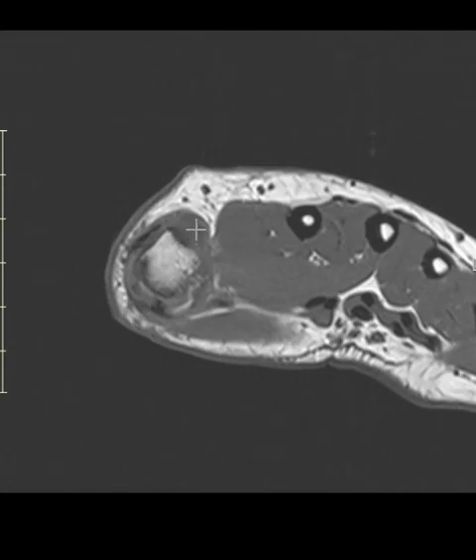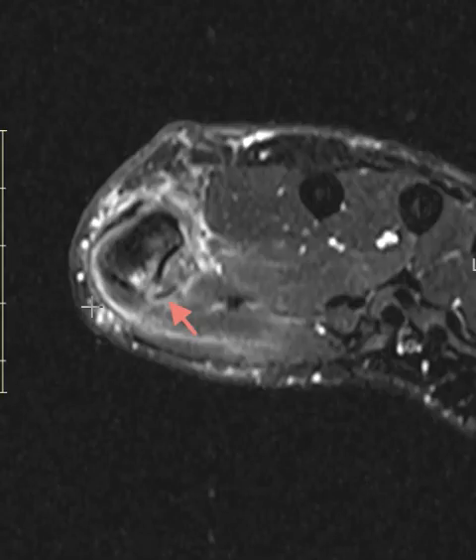This is that UCL that's torn — it's probably getting balled up here, that's why it's so much surrounded. Over here on the radial side, the radial collateral ligament is also at least partially torn. And then finally, that cortical avulsion fracture. Thank you so much.